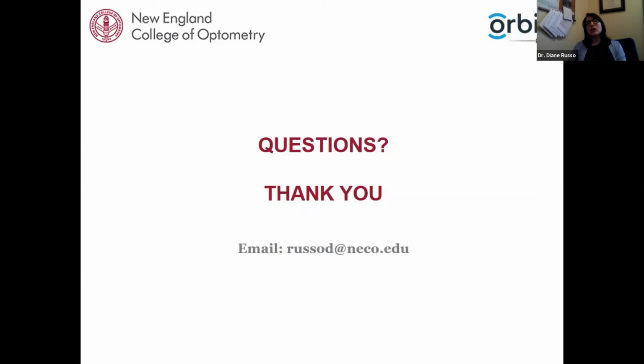But you could also have a very dull glow because of high refractive error. So if you're getting a dull reflex during retinoscopy, it could be that the prescription's very high. It could either be high minus or high plus. And if that's the case, you can put in a very high, let's say even +5 or +6 or -5 or -6, and then see if that increases the reflex, if it becomes brighter, because it could just be that it's dull because of the amount of refractive error there.